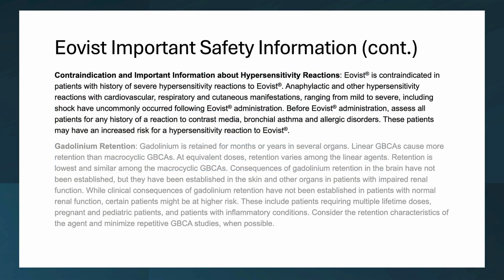Table 2, shown here, demonstrates the proportion of correctly characterized lesions per each diagnostic procedure. EOVIST is contraindicated in patients with history of severe hypersensitivity reactions to EOVIST. Anaphylactic and other hypersensitivity reactions ranging from mild to severe have uncommonly occurred. Before EOVIST administration, assess all patients for any history of a reaction to contrast media, bronchial asthma, and allergic disorders.